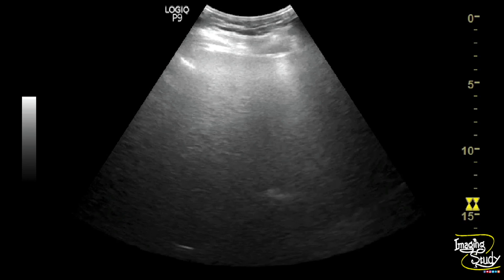Here's the best picture of the hepatic parenchyma in this case, and you can see that vessels and diaphragm are almost not visualized due to excess sound beam attenuation by the fatty tissue.